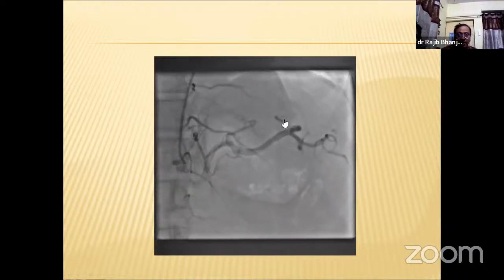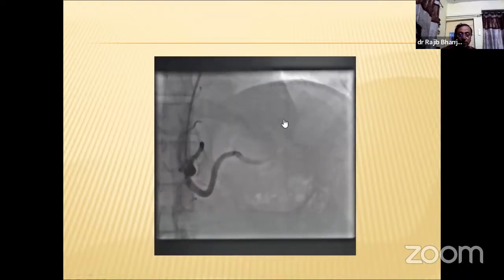Then I did this, I saw again some aneurysm-type picture. Then I rewired the splenic artery. And if you see, there are 2 wires. One is in the hepatic, common hepatic, another one is in the splenic artery, and 3 wires basically I put. Another one is in the left gastric.